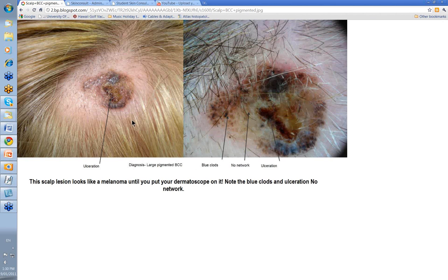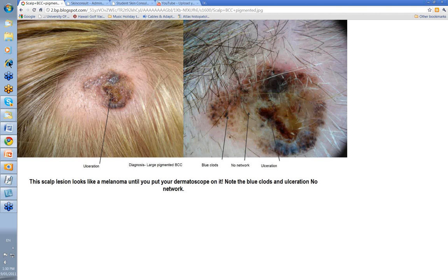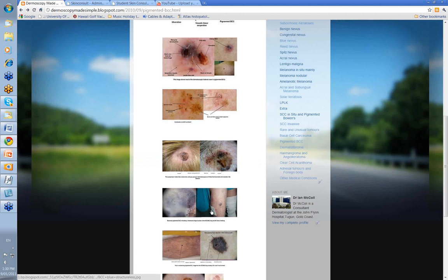Here's a lesion in the scalp. Before cutting the hair away, the clinician thought it was going to be a melanoma. There's an area of ulceration here corresponding to this area, and this is the darkly pigmented blue-grey structureless area with blue clods scattered through the lesion. It has the dermatoscopic features — there's no network. Remember, pigmented BCCs don't have a network. So this was entirely a pigmented basal cell skin cancer in the scalp.